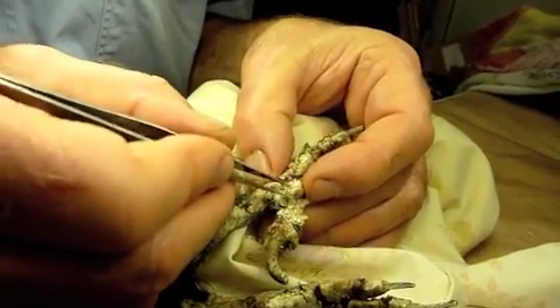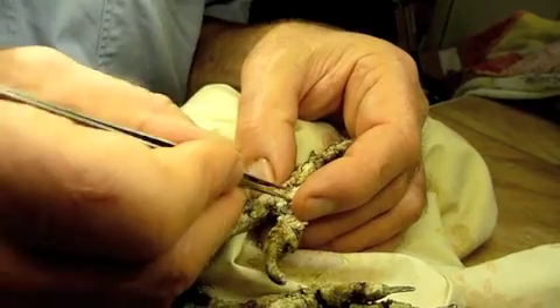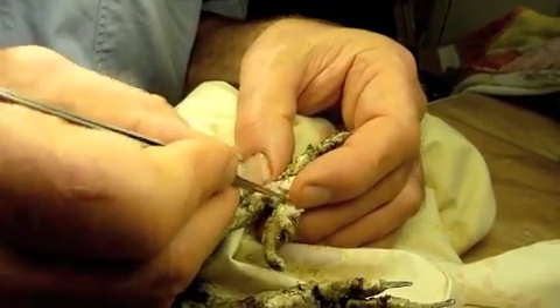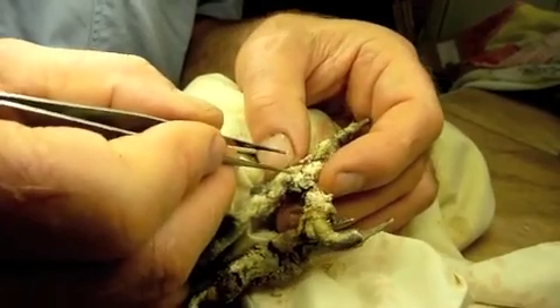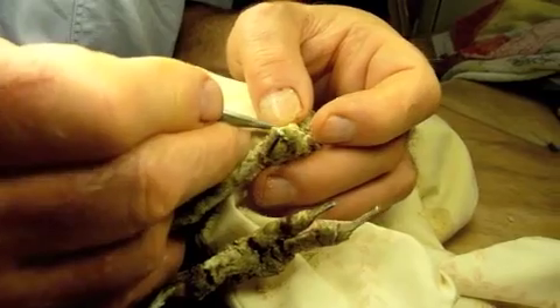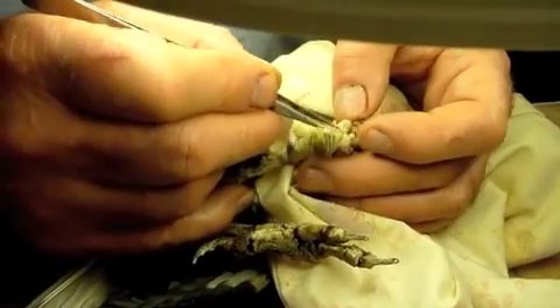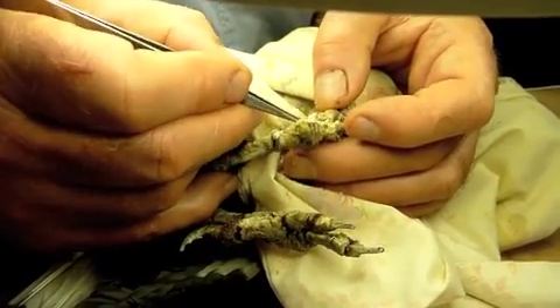We'll just go along parallel to the skin and we might loosen it up — steady, calm, calm, calm. Lots of people would prefer to wear gloves and that's a personal choice.